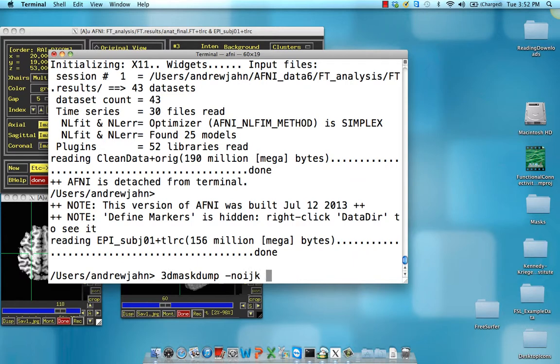And no IJK, because we don't want the coordinates to be spit out as well. And dbox, we are going to give it the coordinates x of 20, y of 19, and z of 53.